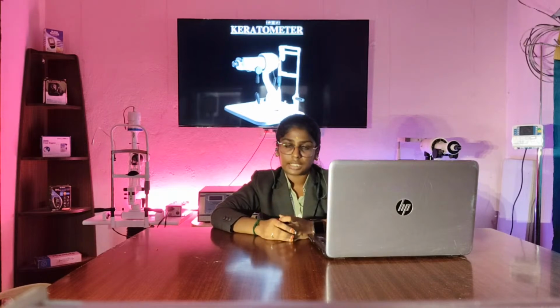We will have common mechanical setups in all types of equipment, like when we want to change the equipment from one position to the other. We want to adjust the height from one range to the other based on the patient size and the eye size, and we can change the locking systems also. Once the patient is fixed in an area, he or she can change position, but the clinicians present in the area must get an appropriate result in the final imaging. So for that purpose, we will have a locking system in every ophthalmology department equipment.